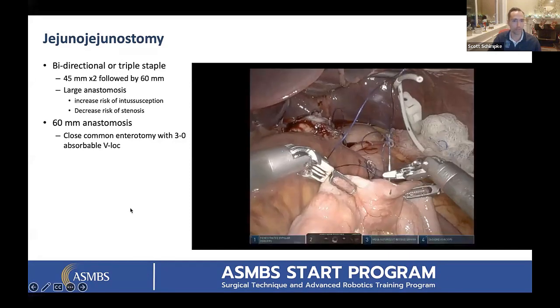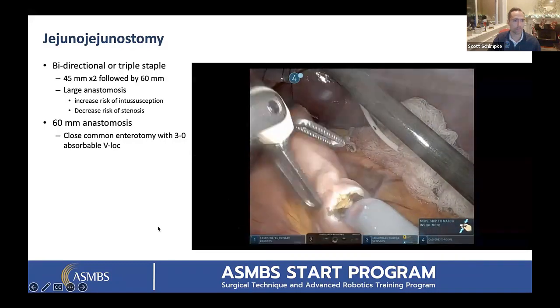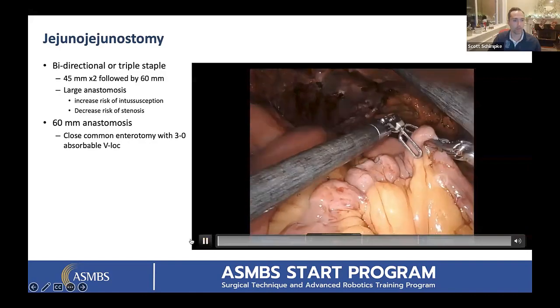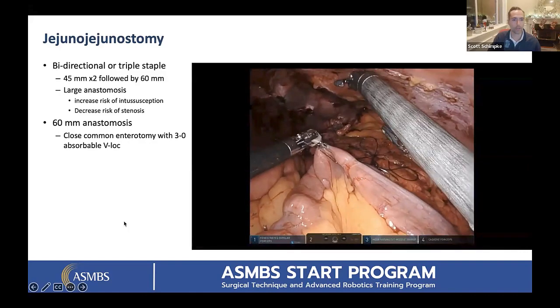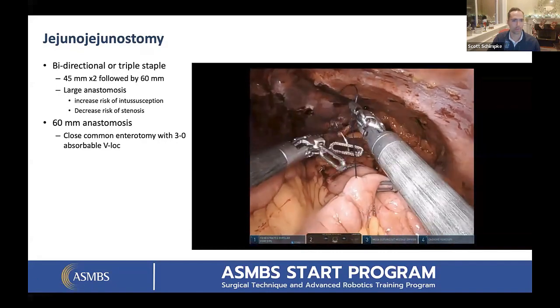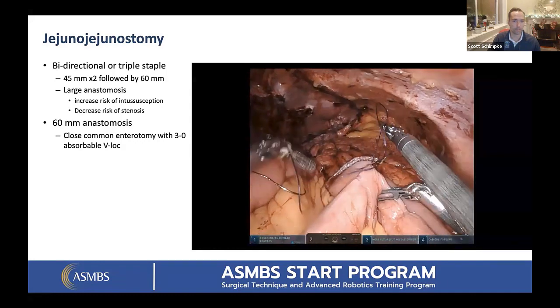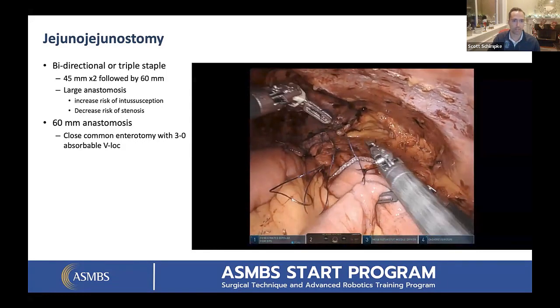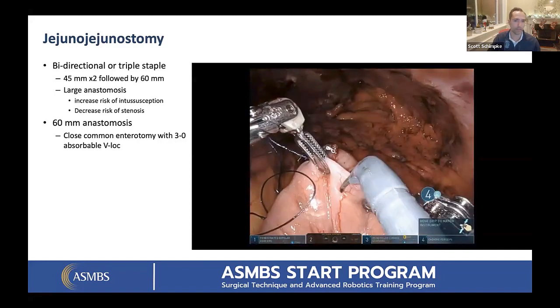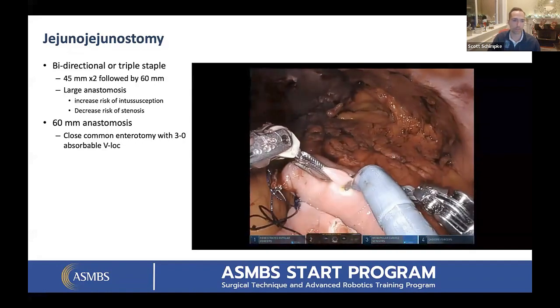And then I'll show you the video of, is this the other one? Oh, I think this is the same video again. Yeah. There's another video. Here we go. This is my partner who, like I said, I do one way. He does the other way, doing the 60 millimeter fire. This is a revision case. So you can see it kind of looks like a bomb went off in there. They're doing the JJ, same exact stitch to tether the bowel together. But in the end, he's just going to do a single fire with arm one, with your left hand firing it from screen. You'll see screen left to right there.